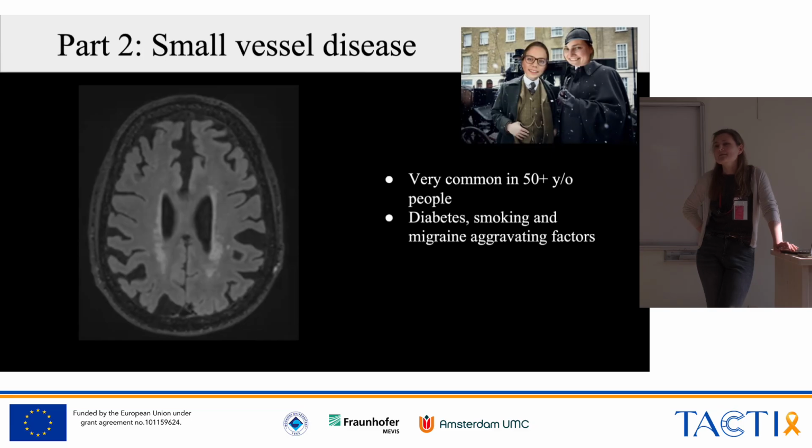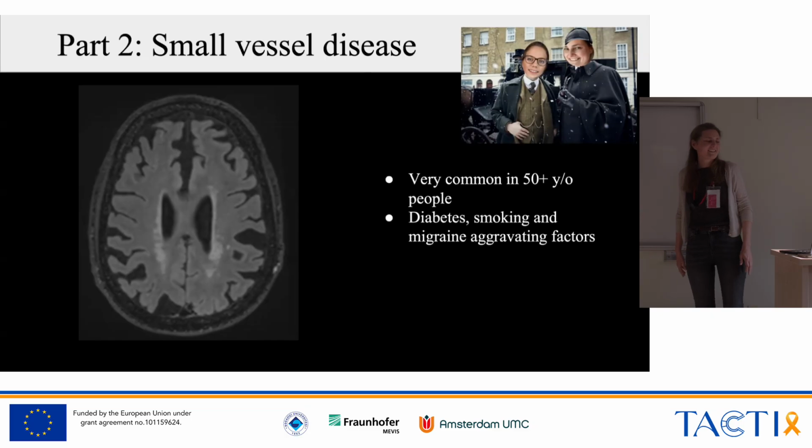Sometimes we sit there with 3 people because we just can't conclude, and say, yeah, but this lesion, if you count in that lesion, then it's more MS, don't you think? And I say, yeah, but all the other lesions, could we maybe mix it, say it's MS plus another thing? And let's see if the neurologists swallow it.